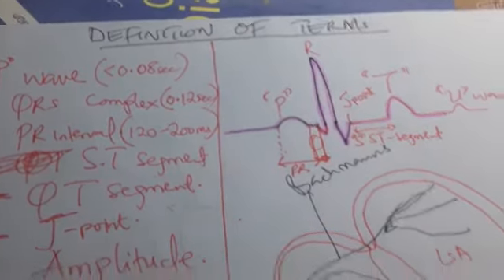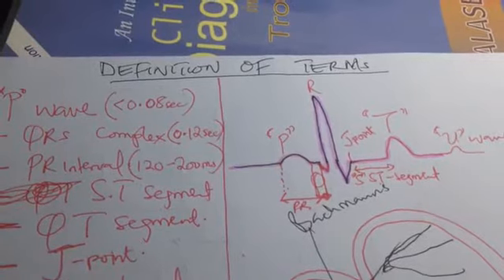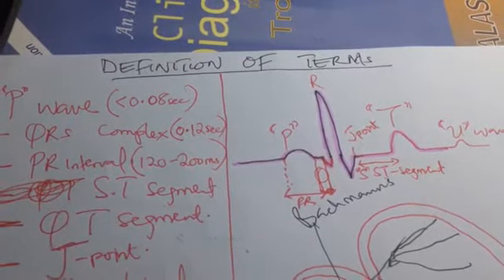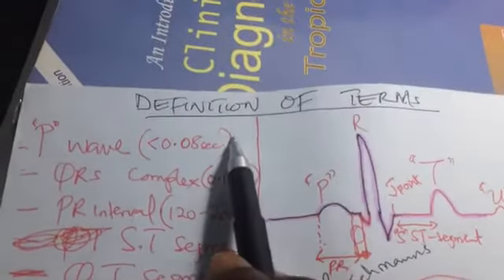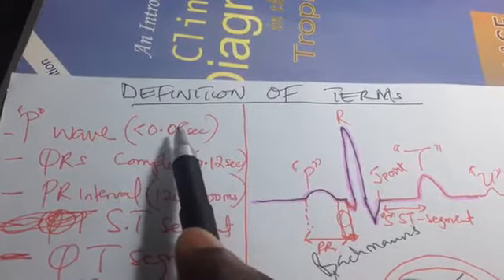Hello everyone. Today we are going to be continuing our discussion of ECG. This will be the second video of the ECG series. Now we are going to be seeing the definition of some terms that you may be encountering throughout the study of your ECG.